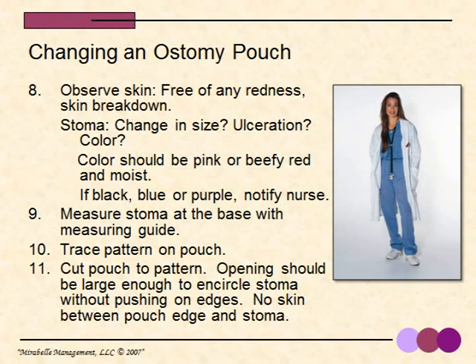Observe the skin. Is it free of any redness and skin breakdown? Look at the stoma. Has it changed in size since you last saw it? Is there any ulceration? What is the color? The color should be pink or even beefy red and moist. If it's black, blue, or purple, you need to notify your nurse. This would indicate a non-viable or a non-functioning stoma, and this is an emergency.